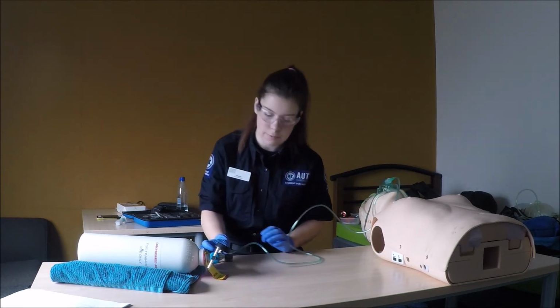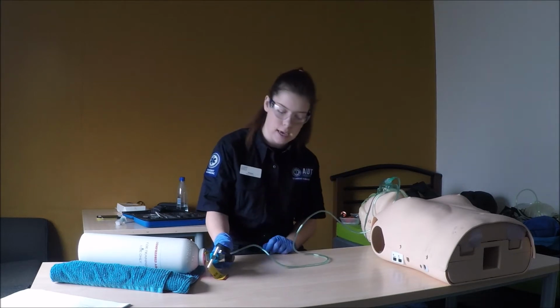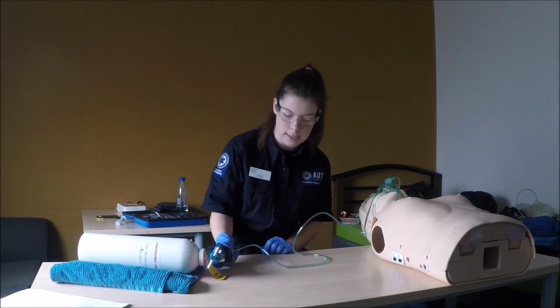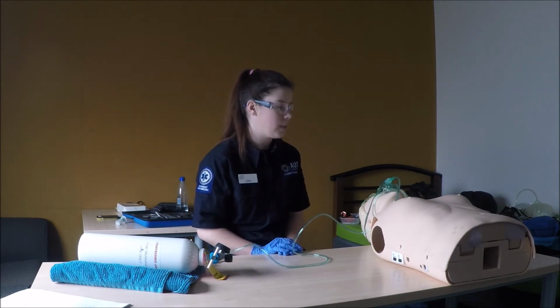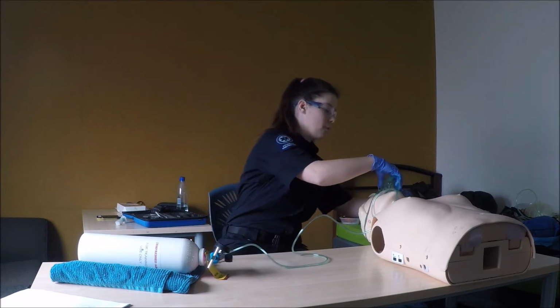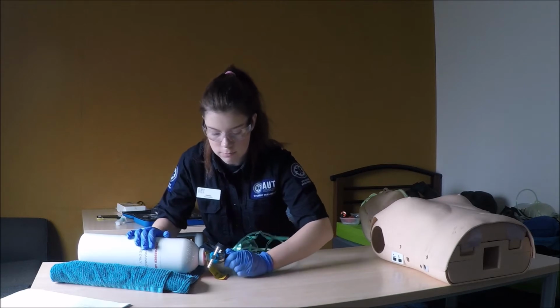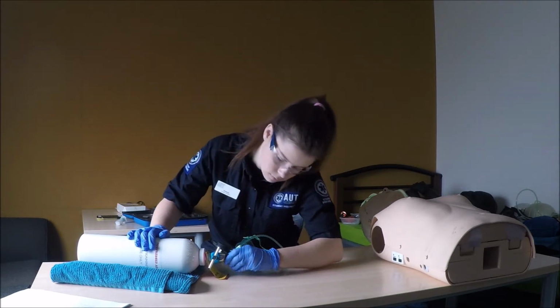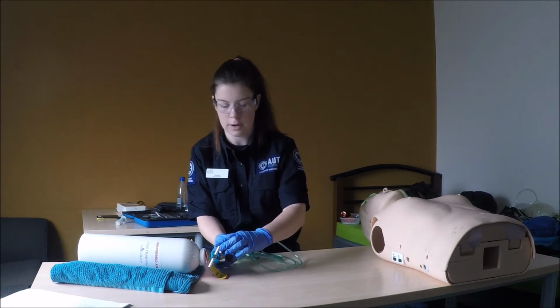We'll then turn the flow rate onto 6 or 8 because this is an acute mask, and so the appropriate flow rate is 6 to 8 litres per minute. Once we're done, we'll turn the flow rate off, remove the mask from the patient's face, turn off the oxygen bottle, and flush out any remaining air from the regulator.